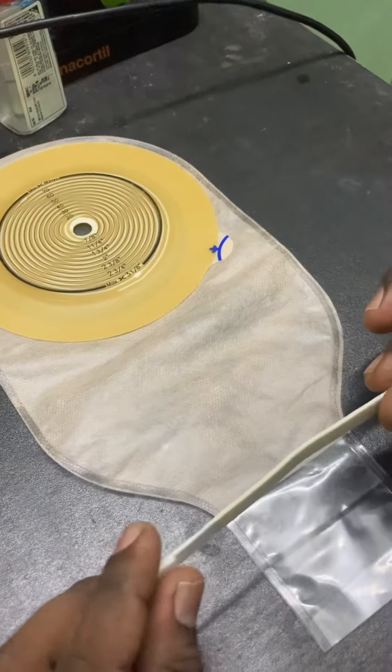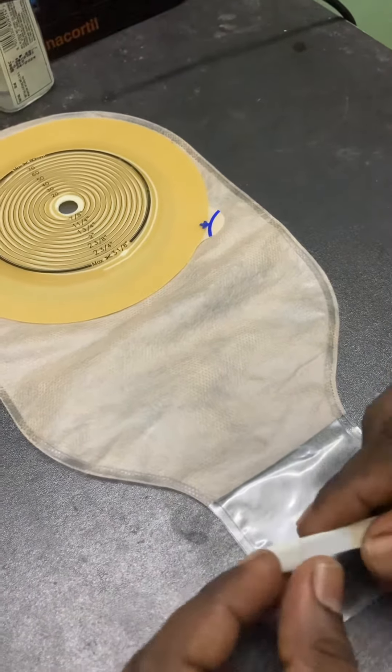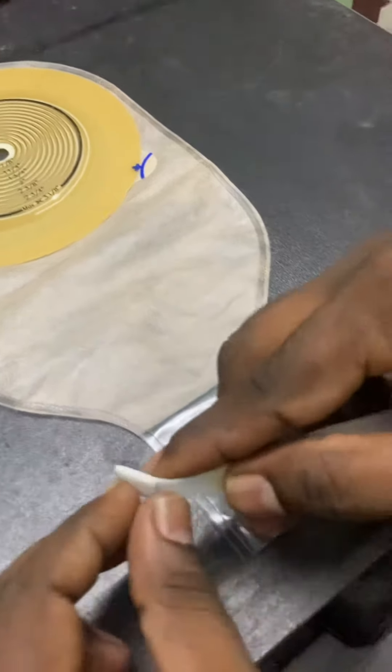This strip is available with every box of this bag. Take out one strip, then I will show you how to fix it in the bag.